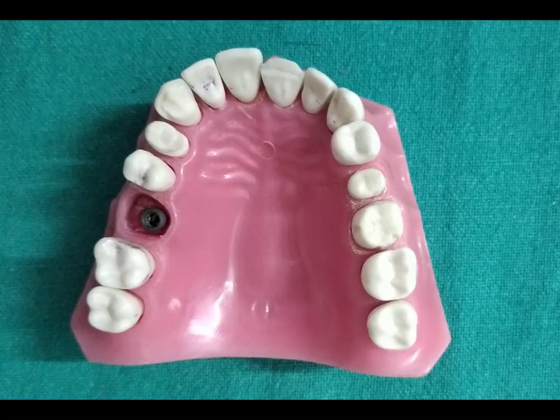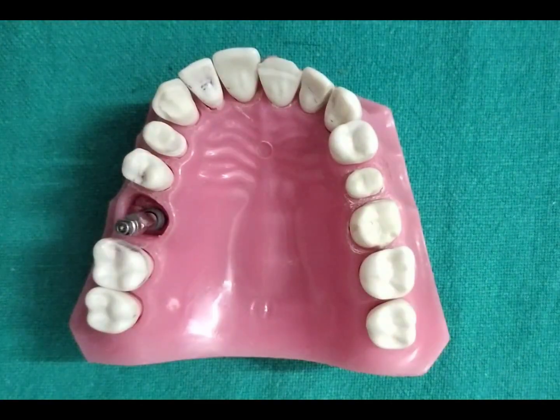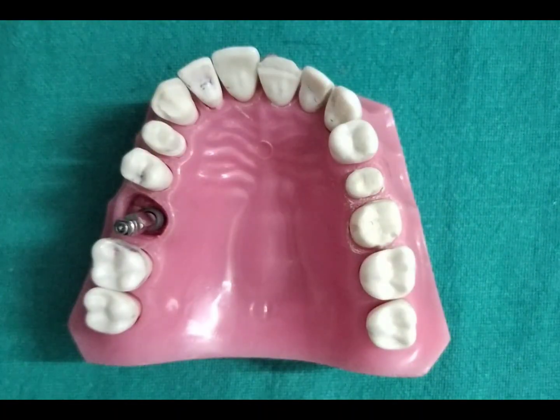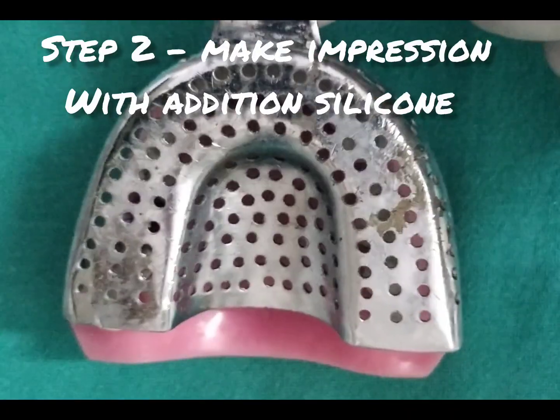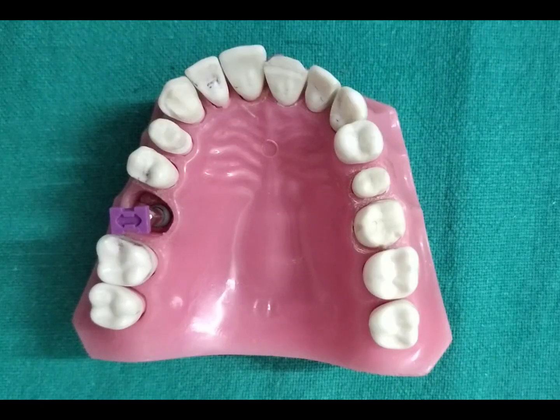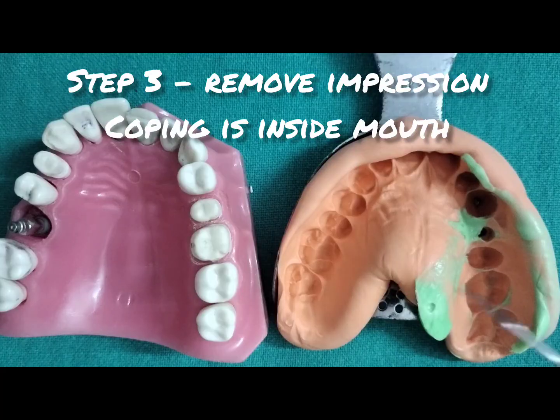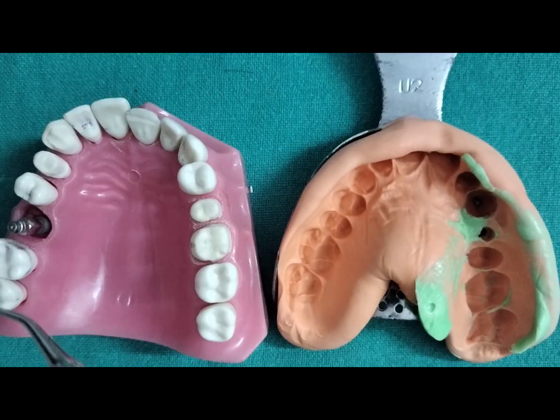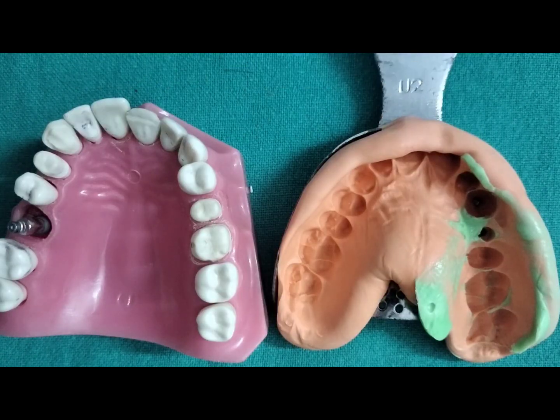First step is to attach the impression coping to the implant. Like this, you position the impression coping over it, and then select a stock tray and you make an impression using addition silicones. So that is step number 2. Step 3 is you remove the impression, and the coping stays in the patient's mouth. Step 4 is unscrew the coping and connect it to the implant analog.